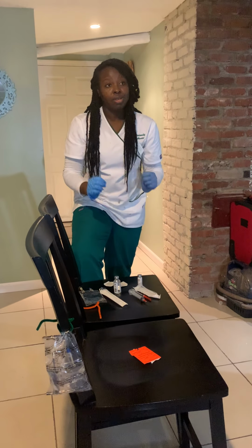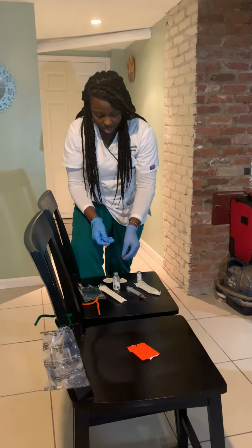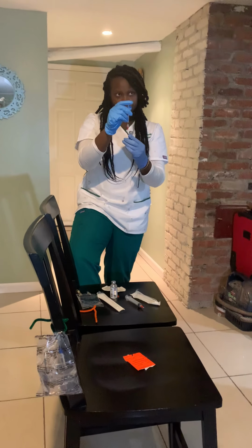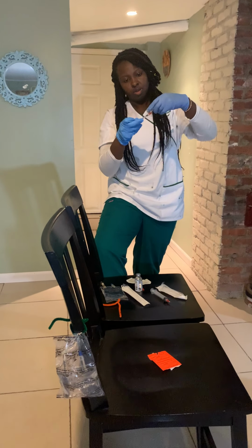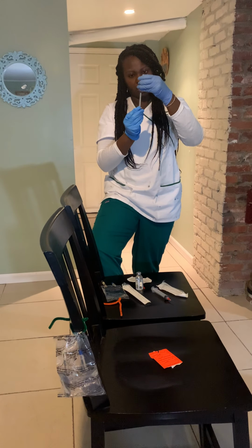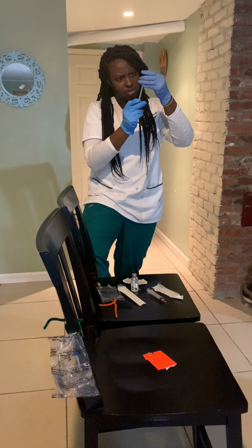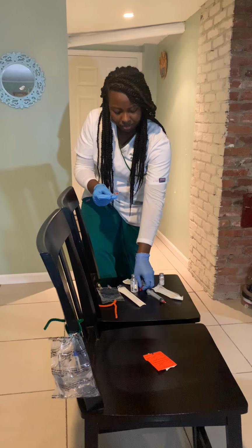Now I'm going to take out my second syringe. I'm going to withdraw according to the MAR. I'm going to take out 1 ml. I'm going to aspirate. Okay, I'm going to put it in. I'm just making sure that we do have the correct amount in here. Okay. Now I'm going to put this back down and recap.